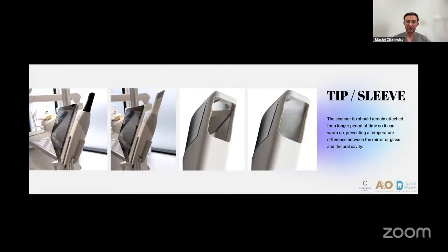It will be slowing you down, because the data will go very slowly to your scanner and also to your computer. So you have to repeat and repeat, and sometimes you have to delay the scanner and do it one more time. So if you want to avoid the problem, it's better to prepare the scanner just like that: it should be warm, and then prepare the tip or the sleeve on it, warming up before the scanning for 1 or 2 or 3 minutes, or depends.